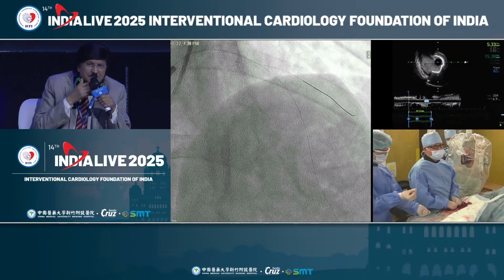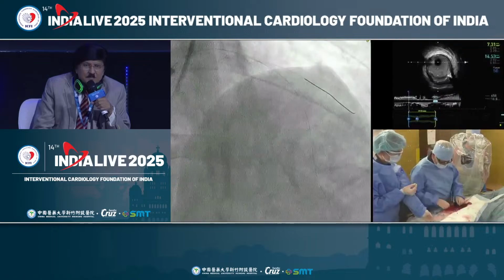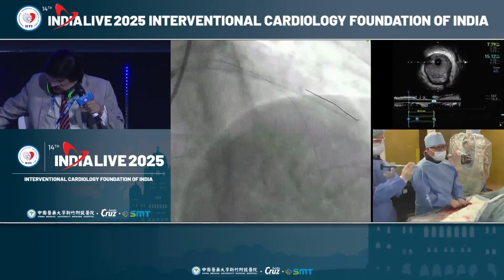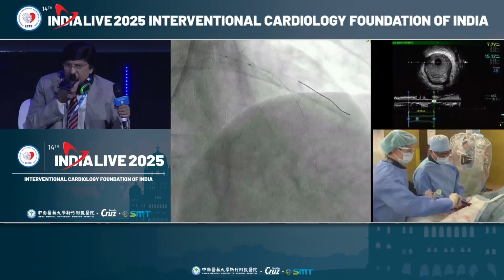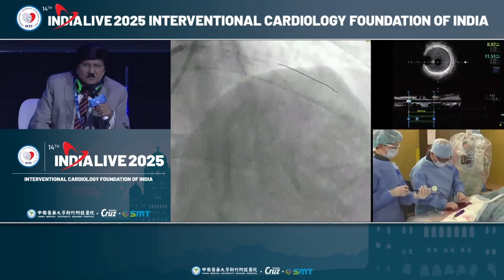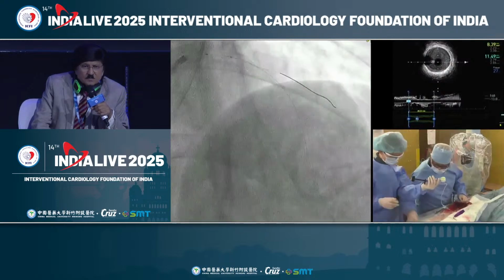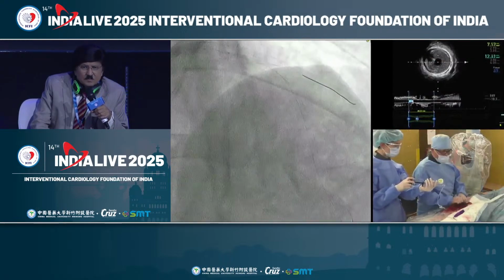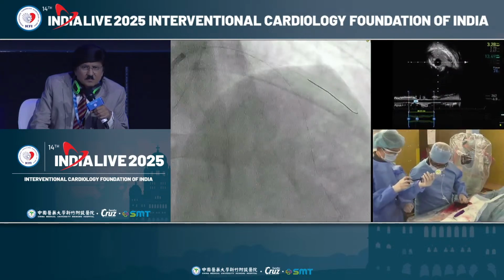To tell the truth, I wanted to use a 2.25 burr for this case. In Japan, it is available. However, I know that in a lot of countries, burrs larger than 2.0 aren't available for rotablation. So today I show you rotablation with less than a 2.0 burr, because a 2.0 burr is acceptable in a 7 French guide, and the wire twist happens.